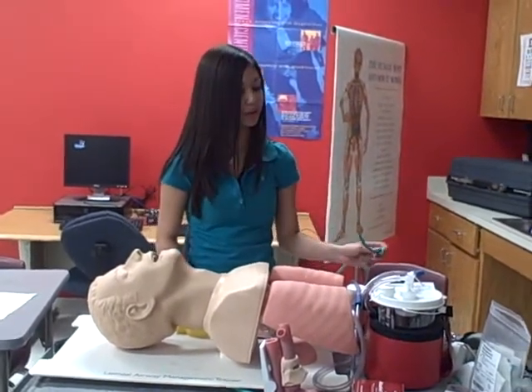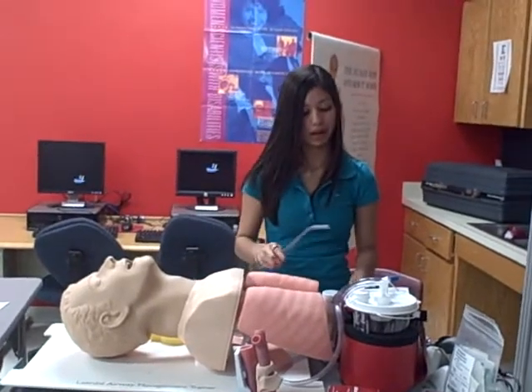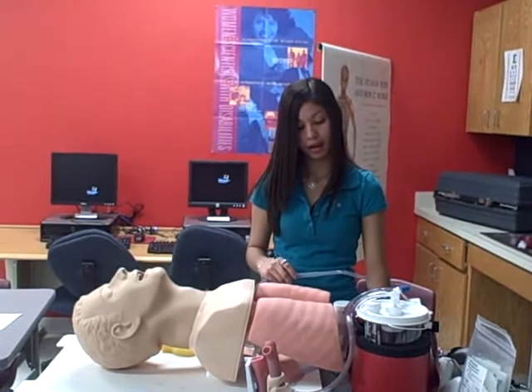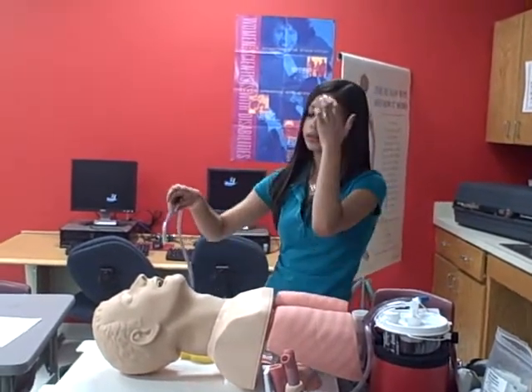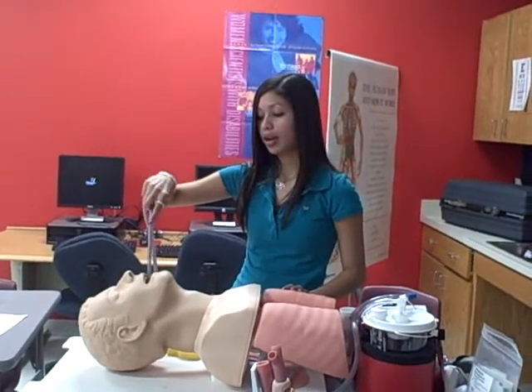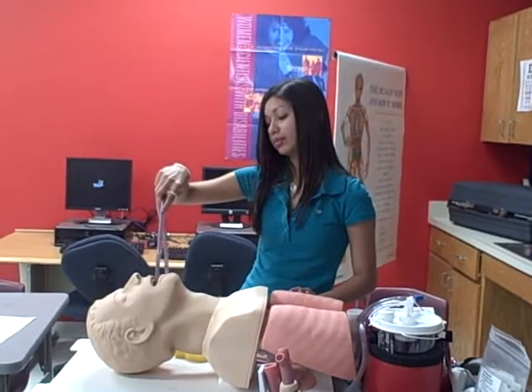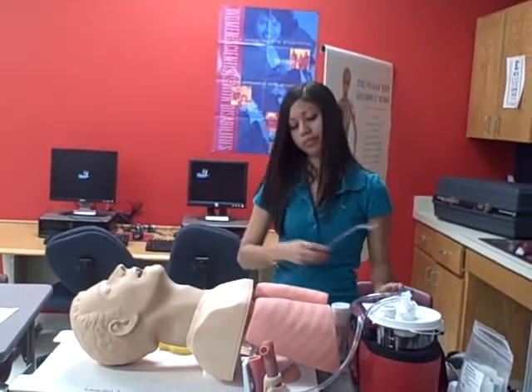And I'm going to do the suction. I'm going to do a circular motion on the way out of the mouth and I'm going to touch the tip of the fork.